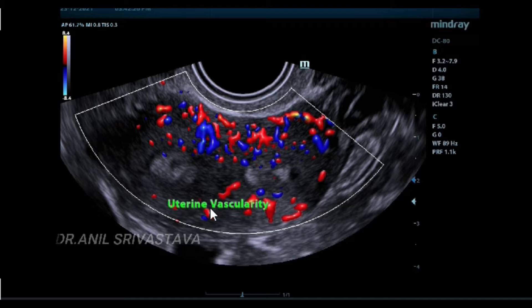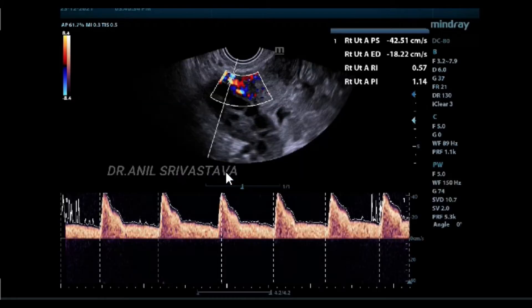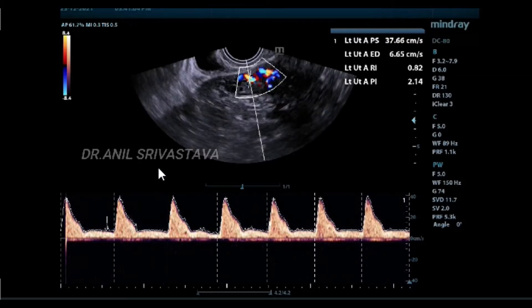This is the uterine vascularity, showing good vascularity. This is the uterine vascularity Doppler, showing good vascularity with a PI of 2.14.